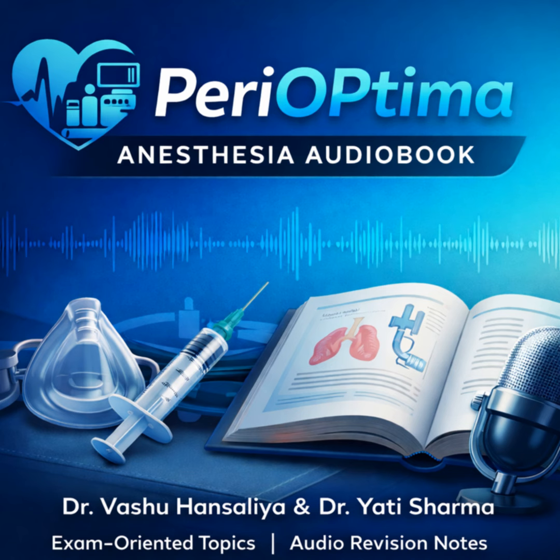through the channel. And the sources mention some specific rigid scopes, which can be confusing. A common exam trap. You must differentiate the flexible intubation scope from specialized rigid devices that also use fiber optics. Like the Bullard? The Bullard Laryngoscope, for example, is S-shaped and rigid. It uses fiber optics for light and image guidance.